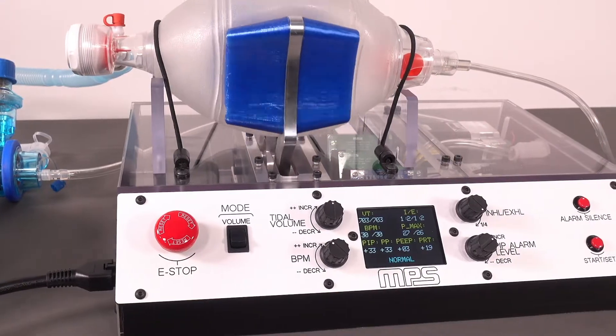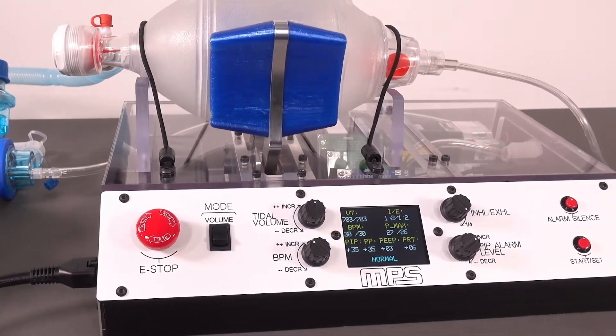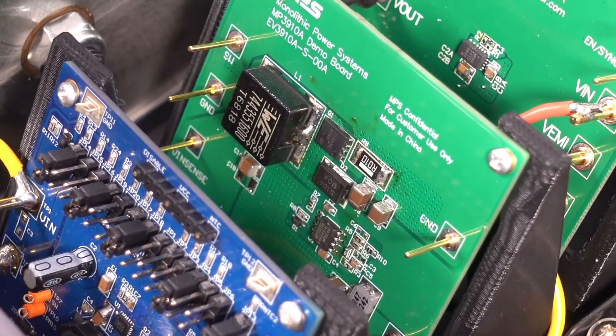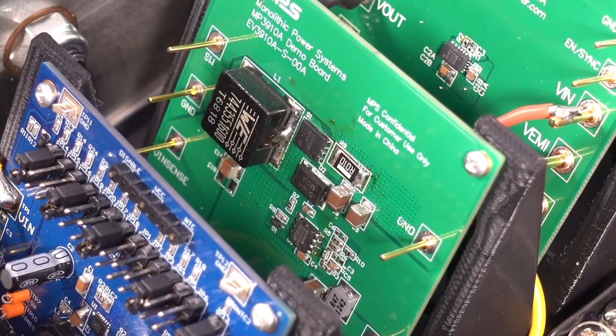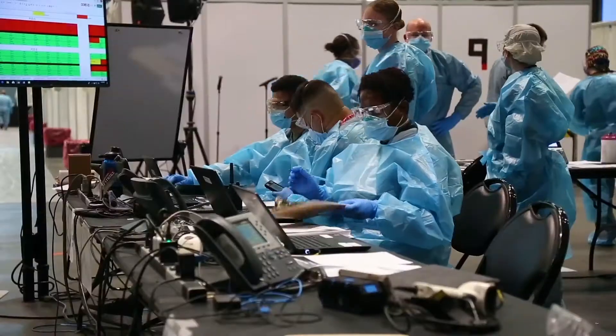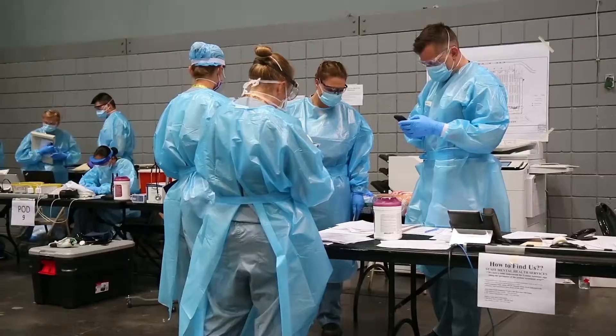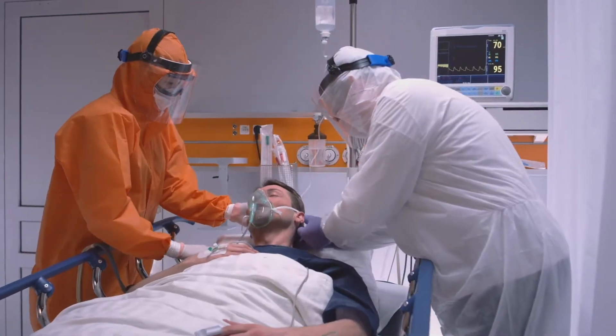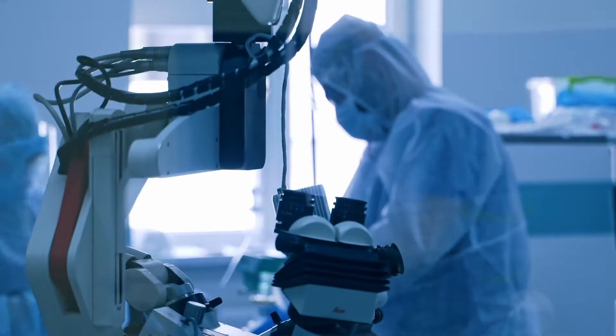The open-source MPS automated bag valve mask system is a prototype we developed in the early stages of the COVID-19 pandemic, as the world was facing a potential critical shortage of ventilators.